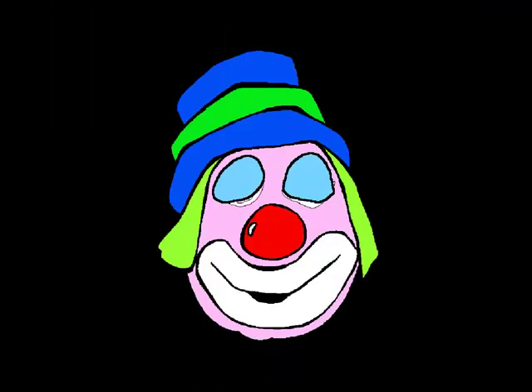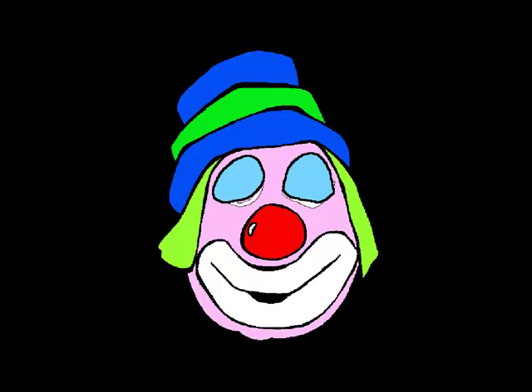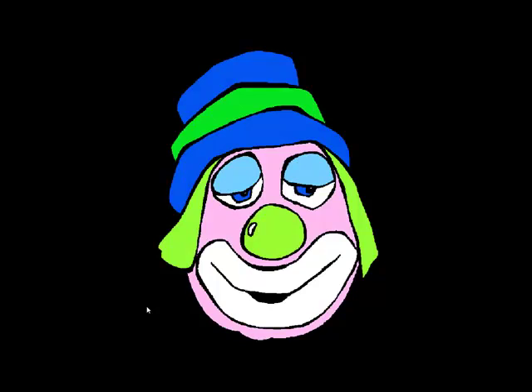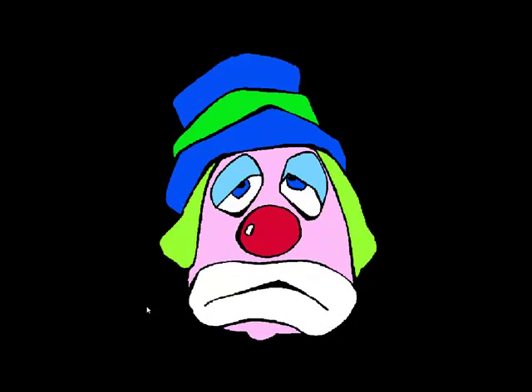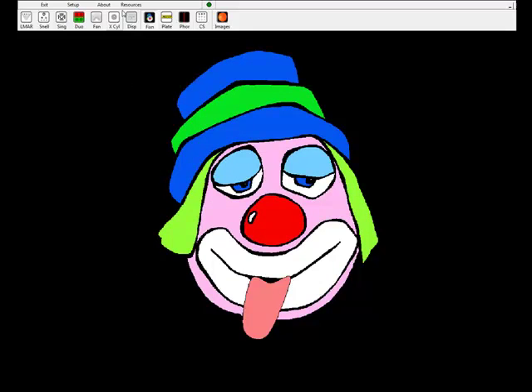Another feature that is quite useful is if you press R on the keyboard, or click on R here, then it will automatically rotate around in the form of a slideshow. This can be very useful, for example when doing retinoscopy. You simply ask the child, tell me when the clown sticks his tongue out. That's a far better way of keeping their attention on the screen.